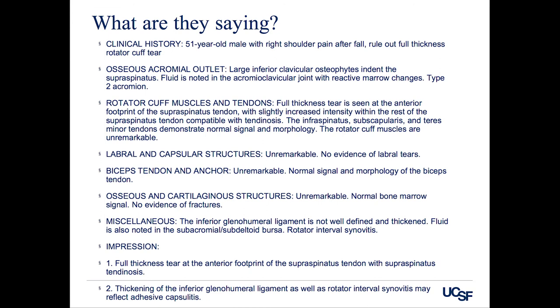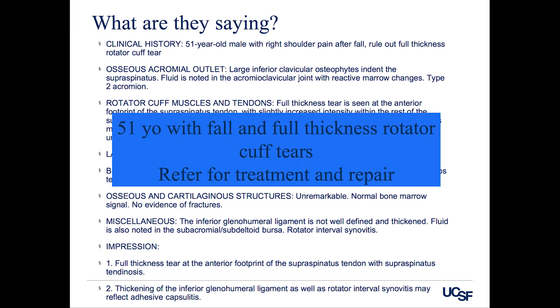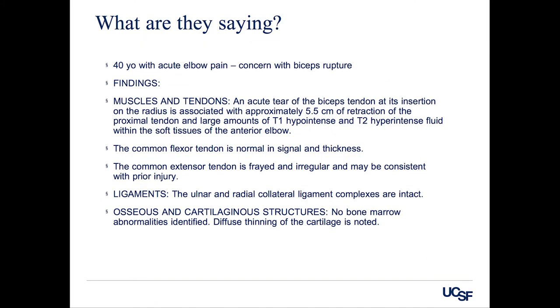So, okay, the adhesive capsulitis part, that doesn't really help us, but they found that there was a full thickness tear, and in someone who's 51, after an acute trauma, this is something that needs to be treated. And usually, for patients like this, after an acute injury, it's better to fix this sooner rather than later. So that was a helpful report for that part.